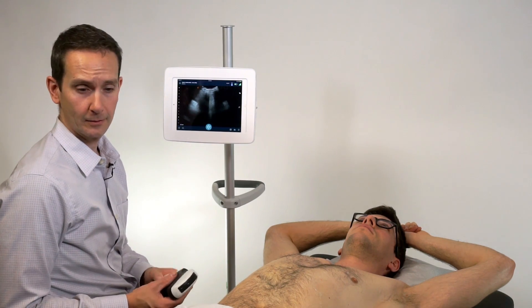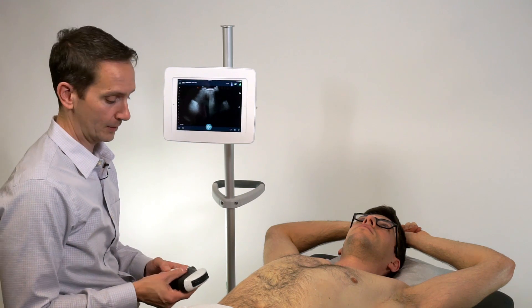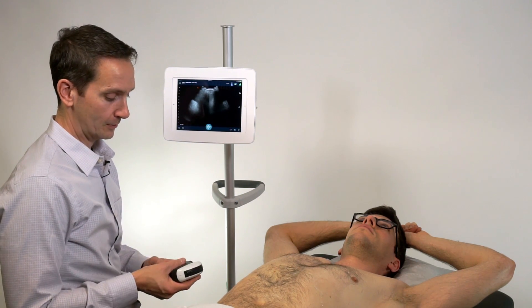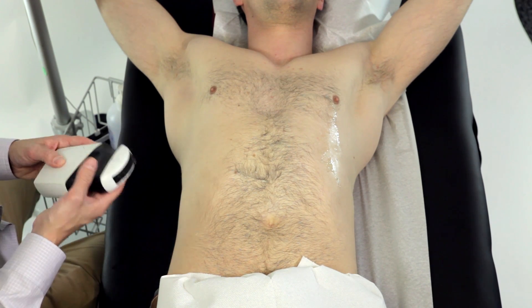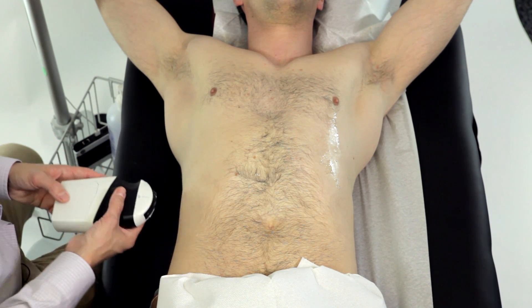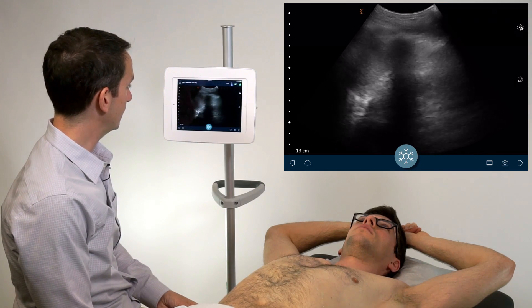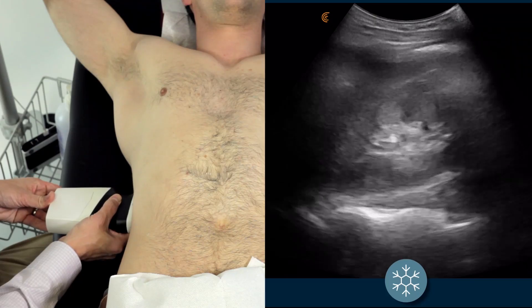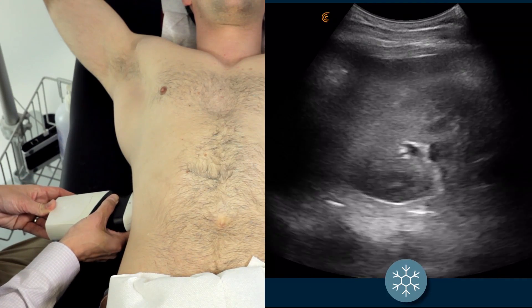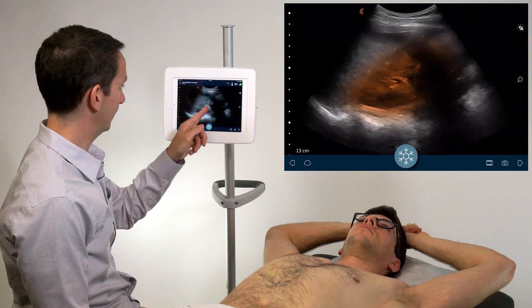We'll start on the right side with the scanner in a longitudinal orientation with the indicator towards the patient's head. Start with the scanner nice and low relative to the body — occasionally that even means putting your hand right on the bed. Come in contact with the patient and then begin sliding the scanner up towards the ceiling until you've identified the hepatorenal interface and the right kidney.